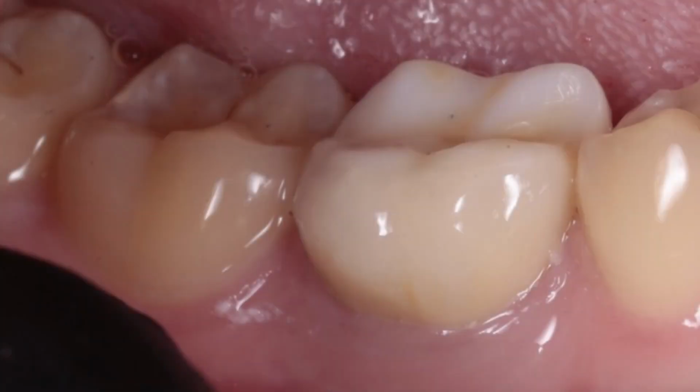In this clinical presentation, I didn't do that. Why? Because I thought that the strong contact point is what I want. And as you can see also on the photo, I thought that the crown was in the right position because it was perfectly stable on the abutment. The contact points were pretty okay, the color was okay, so I decided that I would cement that crown.